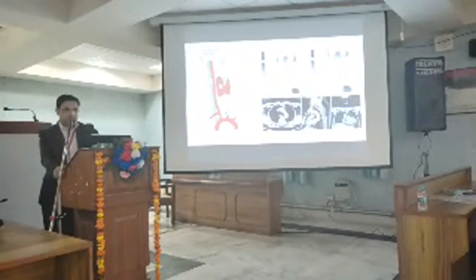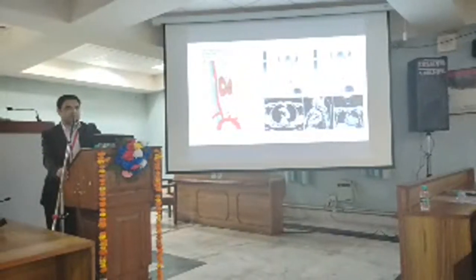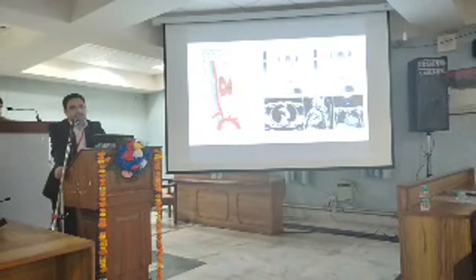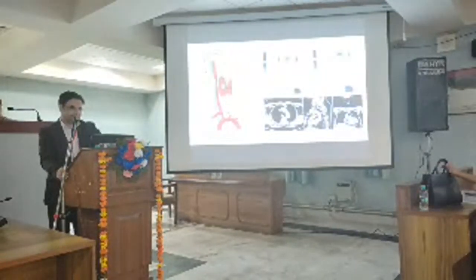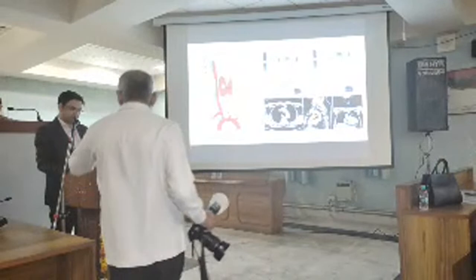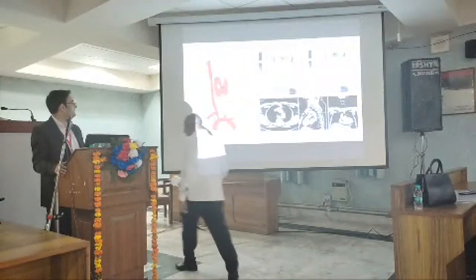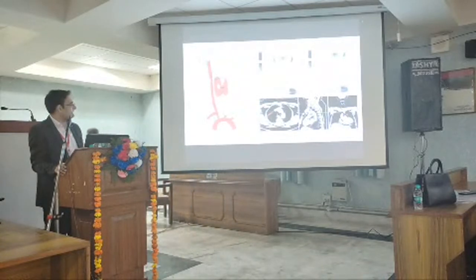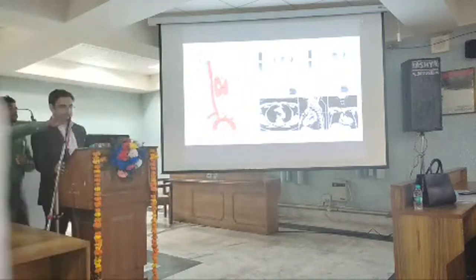Sometimes the SPECT CT or the sestamibi scan is not 100% accurate, and it may be falsely negative in a few cases. That is because of the overexpression of P-glycoprotein, so the sestamibi gets washed out from the gland. Another issue is the localization of the parathyroid. Instead of the normal position, it may be an ectopic parathyroid localization. So we image from the cervical region up to the mediastinum and heart region, so the entire spectrum of ectopic parathyroid adenoma can be covered.